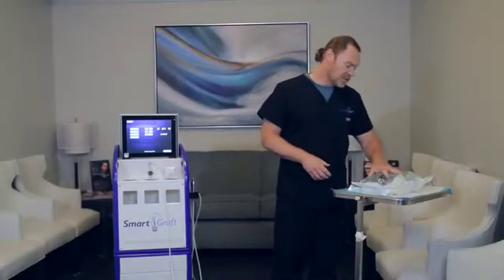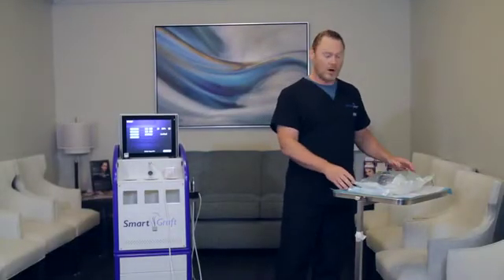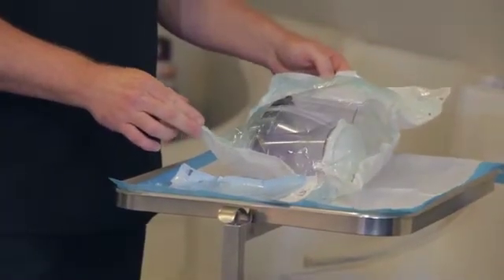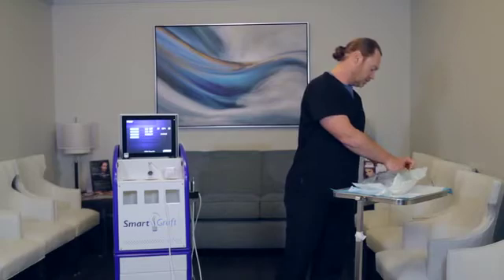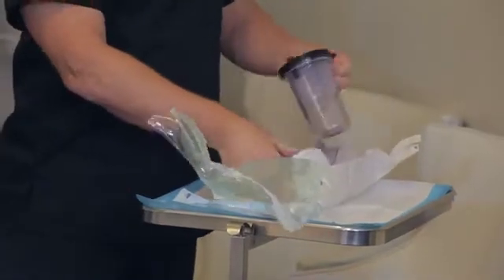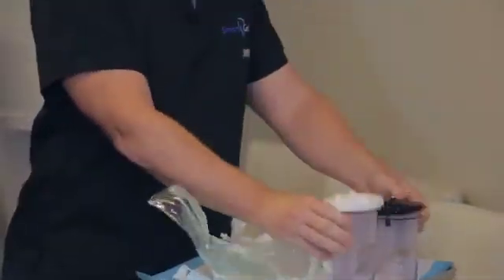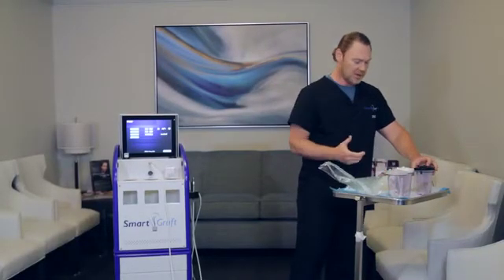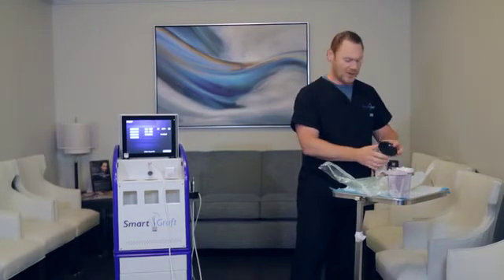Over here you have disposable packs. They are autoclaved just as in the pack itself. So first thing you want to do is open this up. You'll notice that there are three different canisters in here, all with different color lids. That really helps you to distinguish which ones go in what places.